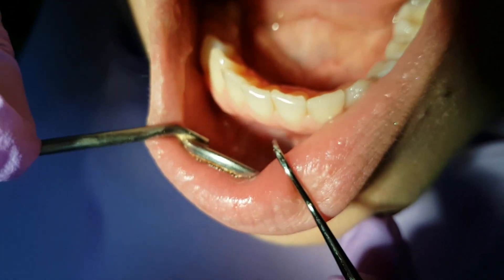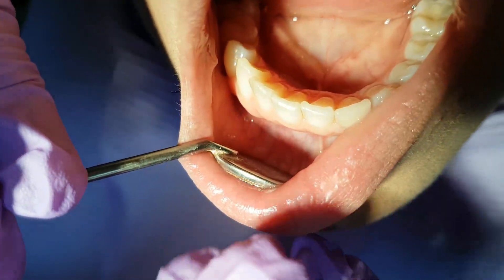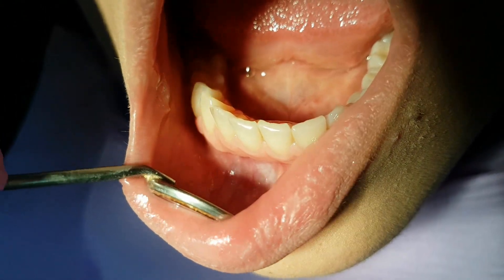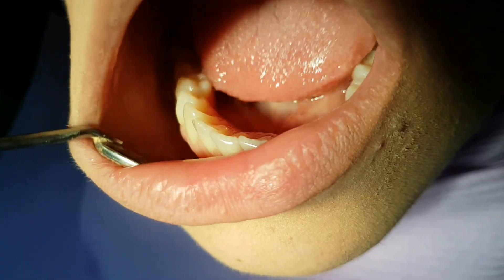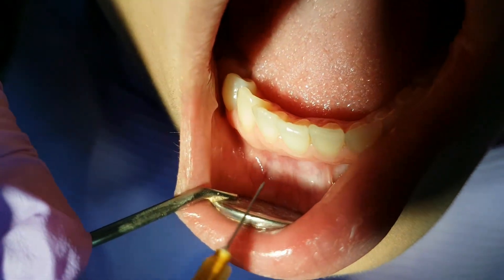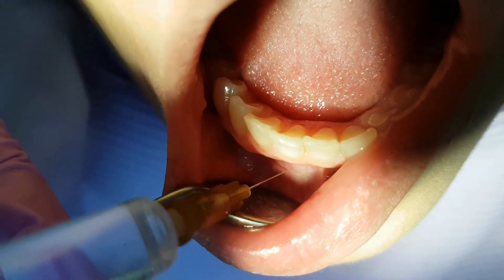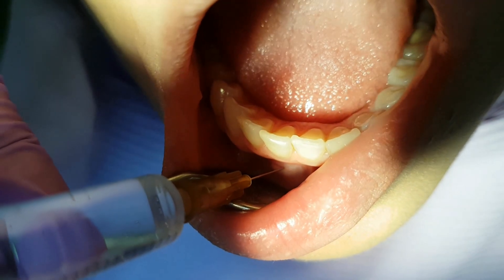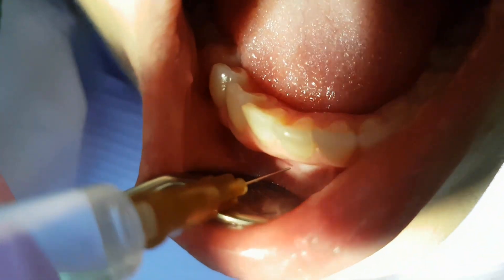The local anesthetic is applied several millimeters above the muco-gingival junction in the alveolar mucosa, in the projection of the foramen apicale of every tooth. We set the needle at 45 degrees, go into the mucosa until we get contact with the bone, check if we are in a blood vessel, and then apply the local anesthetic.